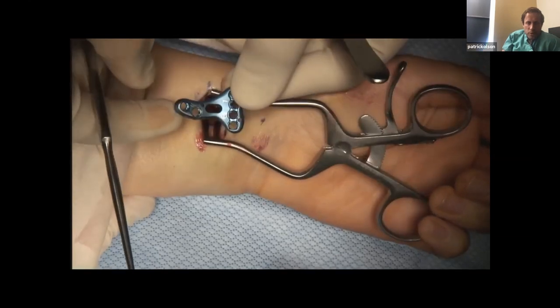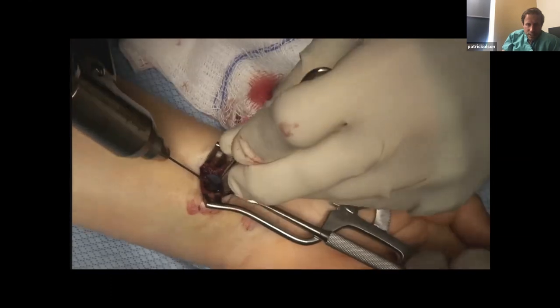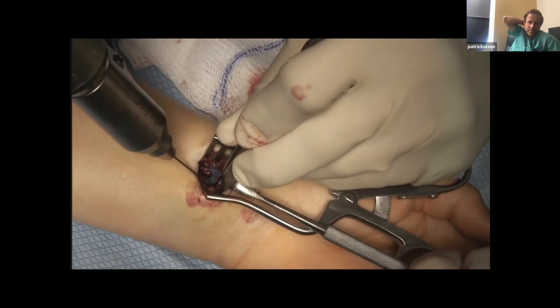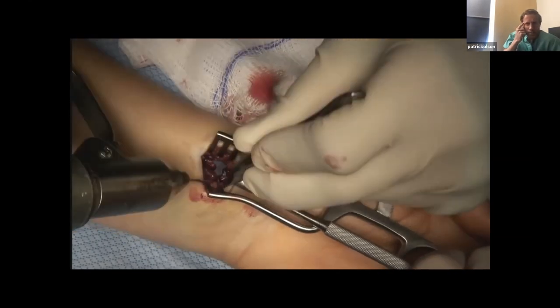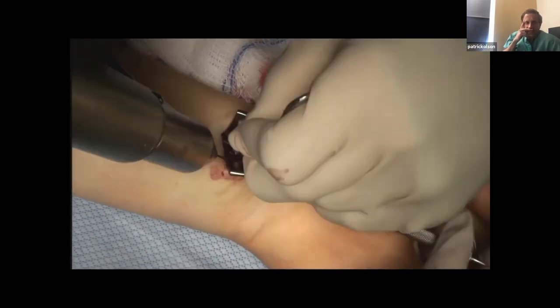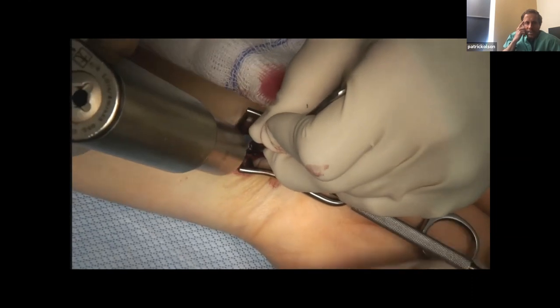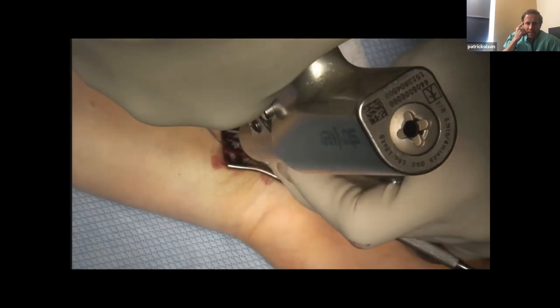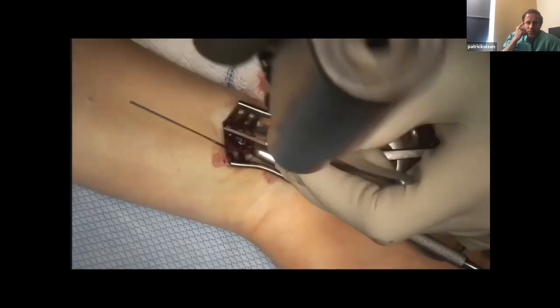The plate comes in a left and a right, and it has two K-wire holes. I like to do a liftoff technique — however you want to do it is fine. I get fixation distally first, and then get that kickstand screw after that.